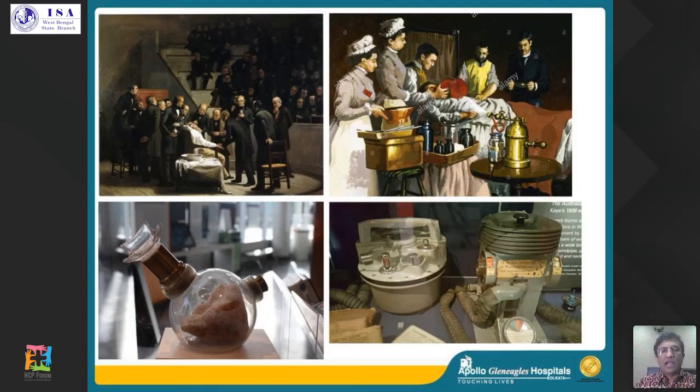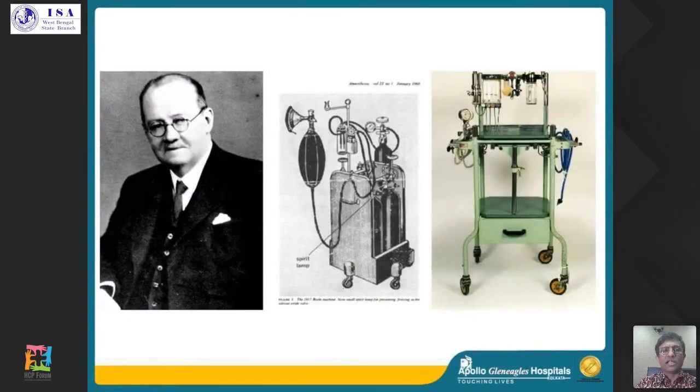So we have come a long way from the 1850s, from where anesthetics were with a rag over your mouth till Morton came out with the first inhalers. Then you had a lot of other things, the vaporizers coming in till this particular gentleman, Boyle, who first designed something wherein you could regulate the flow, blend the gases, and give it possibly at a desired concentration.